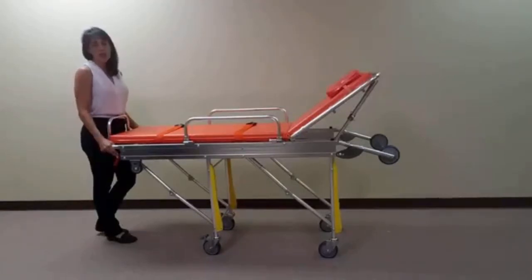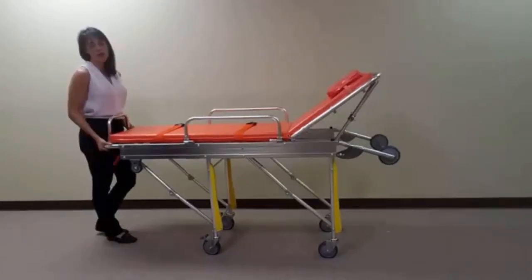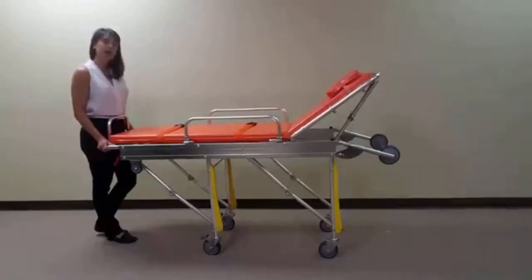To raise the stretcher, simply lift up on the frame until the legs spring back open and lock into place. This next clip will demonstrate lowering and raising the stretcher.